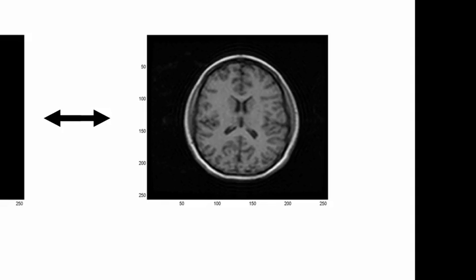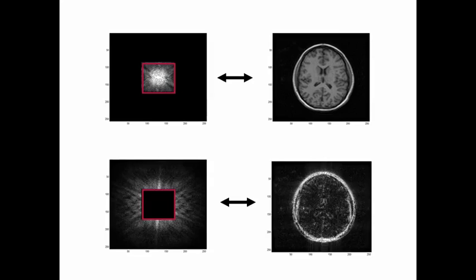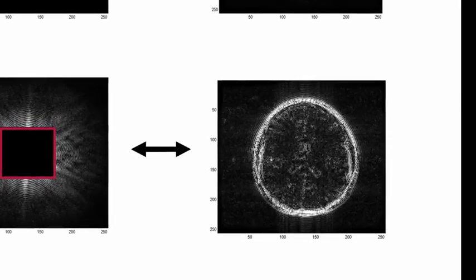If you look closely, you can see the boundaries are not as sharp, and you can see a little bit of ringing in the brain. But this is only 1/9 of the K-space measurements, so about 11% of the K-space measurements. So using only 11%, we've lost relatively little. Now let's look at the remaining 89%, so the other 8/9. If we reconstruct the images using those 8/9, we get the following.